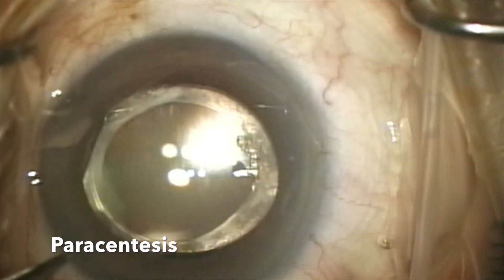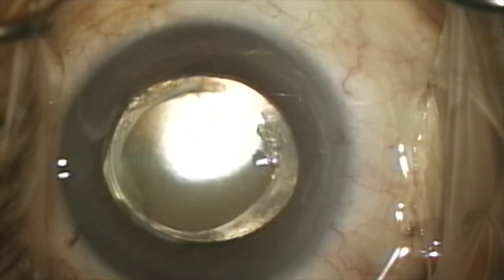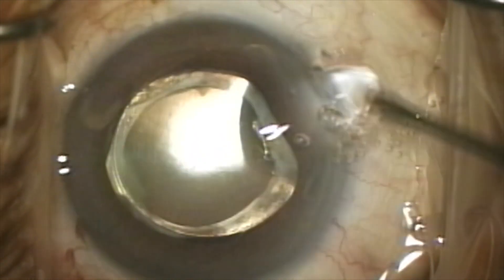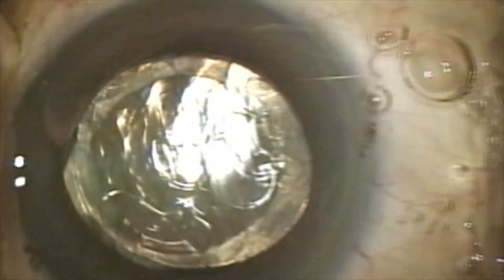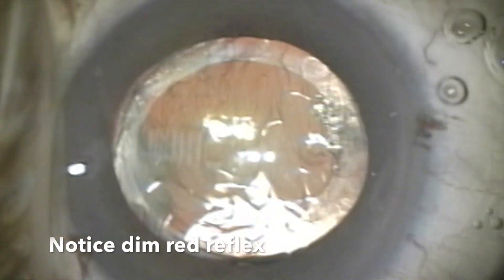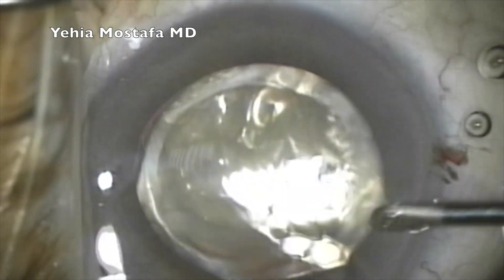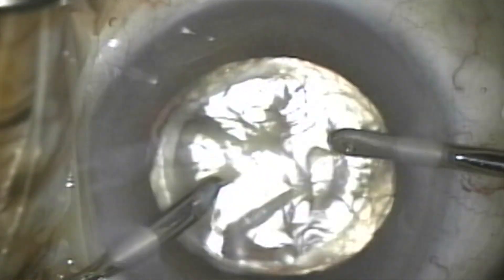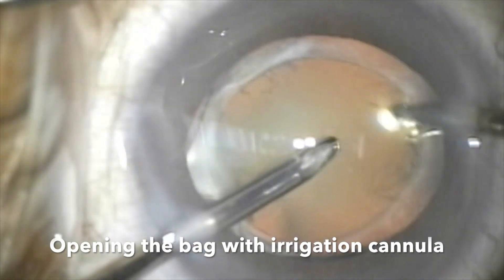Two paracenteses are made to allow access to the anterior chamber. Viscoelastic is injected to maintain the anterior chamber. You can notice the dim red reflex due to the presence of the turbid fluid. With the use of a sharp-edged irrigating cannula, adhesions between the anterior capsule and the lens surface are released to gain access into the capsular bag.